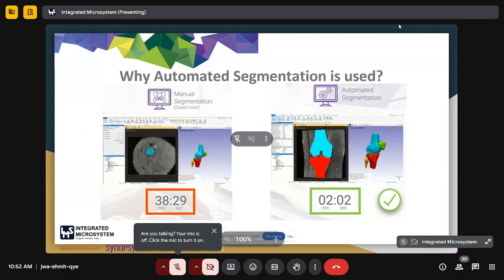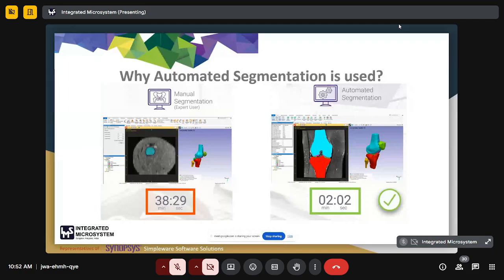with a single click. These capabilities are especially valuable in settings where time is critical, such as surgical planning, designing prototypes, or large-scale clinical studies. For example, a hospital can use AI software to rapidly prepare anatomical models for 10 hip surgeries scheduled in a single week. The consistency and accuracy achieved using AS Ortho modules ensure that each case is handled with the same rigor even with different personnel involved.